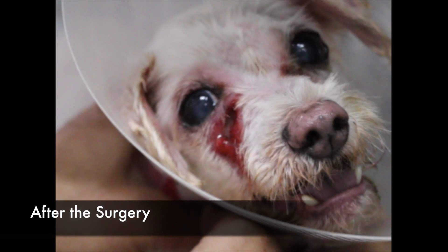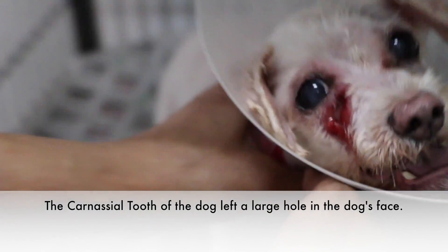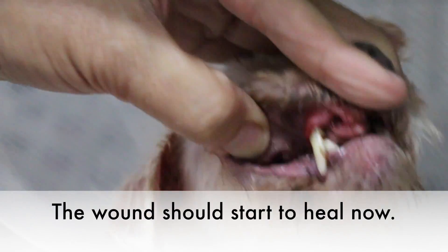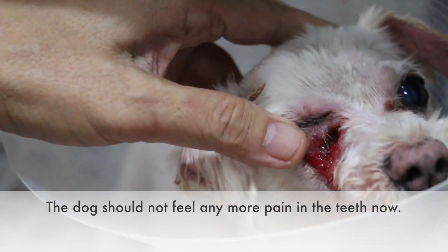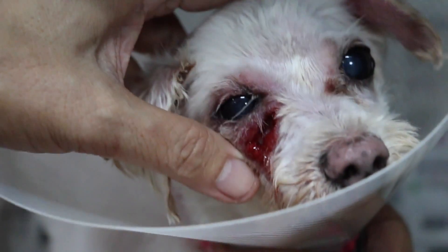We will get rid of the roots here. Now you can see very clearly the hole there — after cleaning up it is really quite big. The tooth has been taken out, the carnassial tooth, so you can see there is no more carnassial tooth. The wound should heal and the dog should not feel any more pain. You can see the hole is very big because the abscess had been left for a long, long time — for many months.